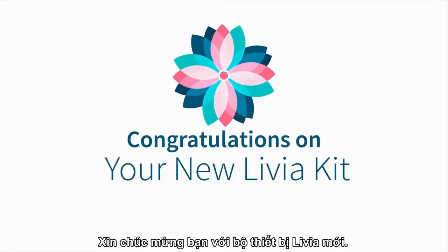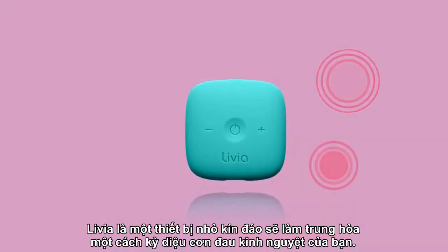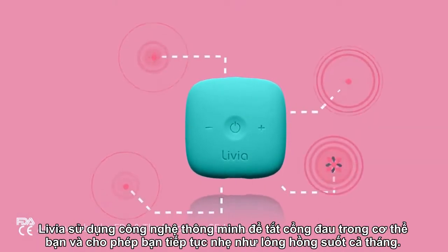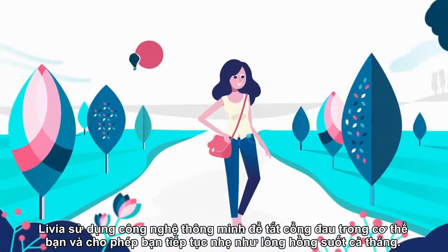Congratulations on your new Livia kit! Livia is a small discreet device that will magically neutralize your menstrual pains. It is the ultimate alternative to painkillers and has been proven to be safe and effective. Livia uses smart technology to shut off the pain gates in your body and lets you keep going as light as a feather the whole month.